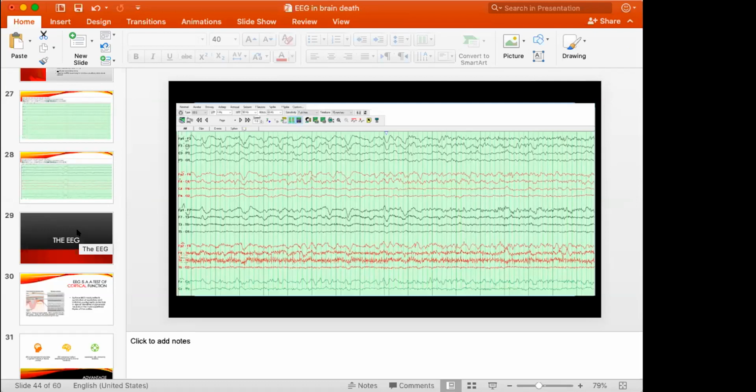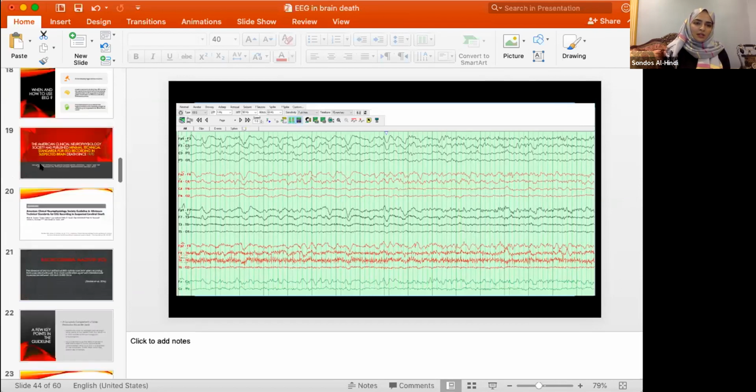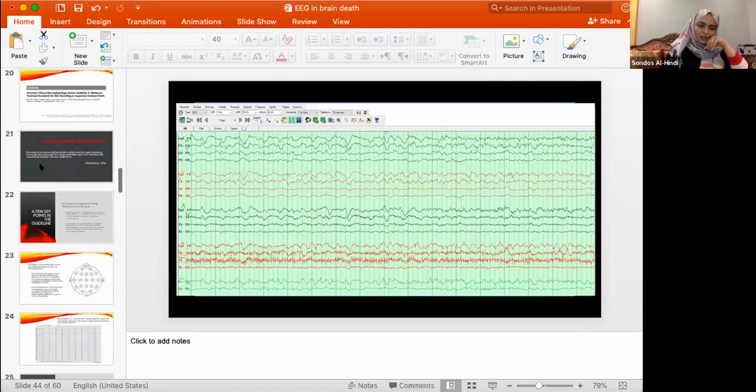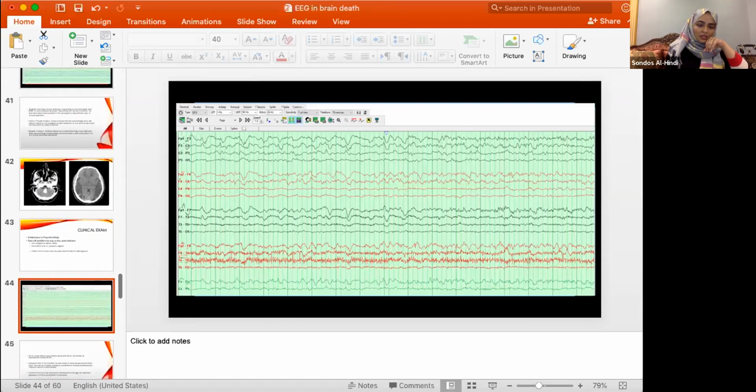Another question from Dr. Al-Hijji: have you seen any brain death patients with a normal EEG? A normal EEG? No. You could be having cerebral activity, just so they know. There is a slide, let me see if I've kept it. So there have been reports.